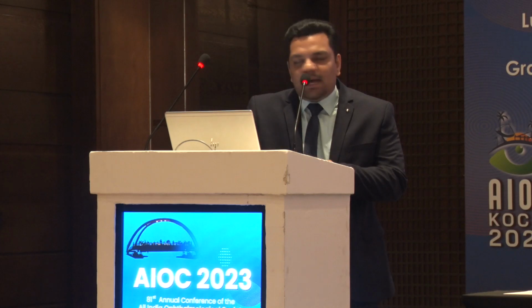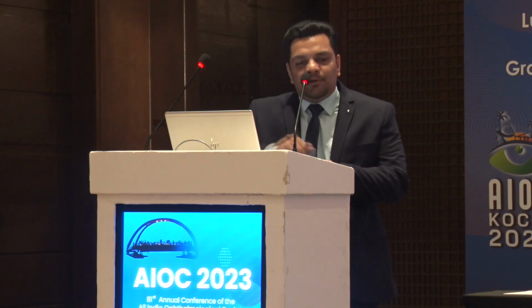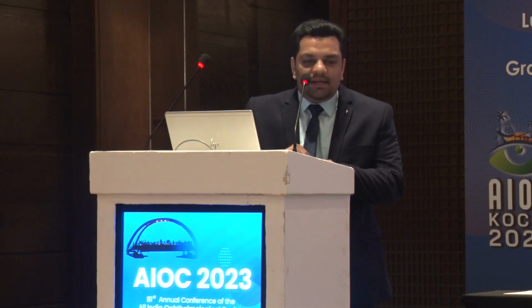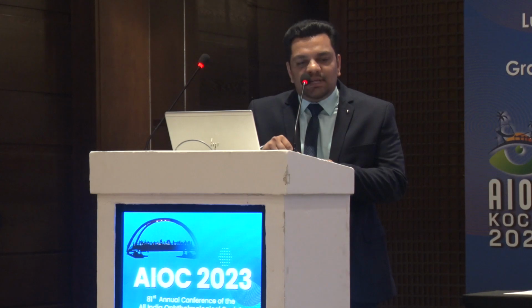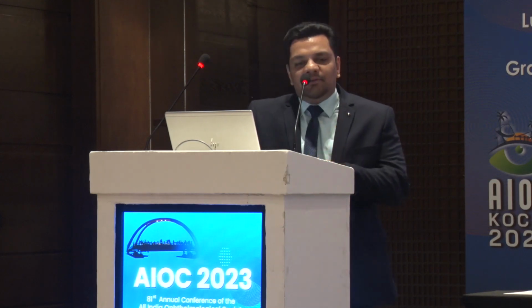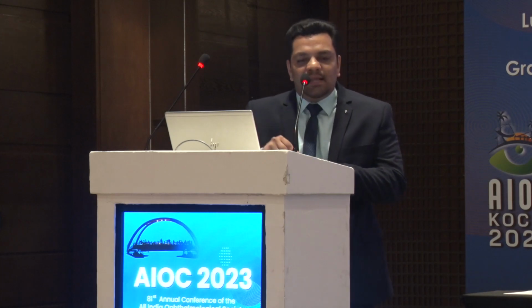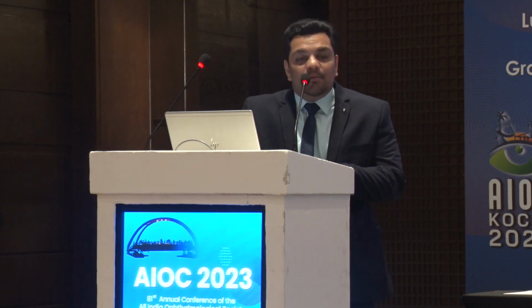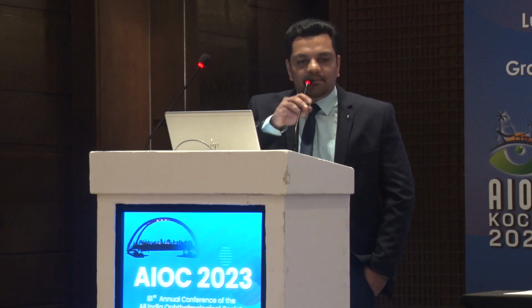IOL, the haptic of the IOL, and externalize it. And the second haptic, I just put inside the vitreous cavity. And then using the same max grip forceps, using direct visualization, I just fish it out. Because once you have cleared off the vitreous, you're not having any problem with the vitreous being entangled in the haptic of the lens. So I just fish it out directly, and then I insert it into both the tunnels which I created with the 1.5 mm keratome.